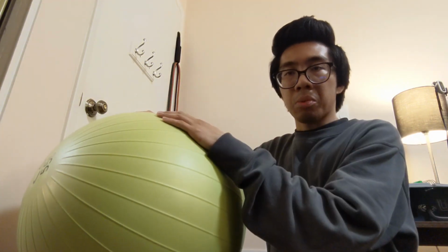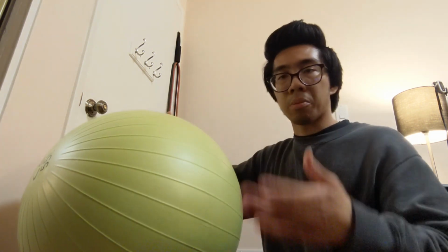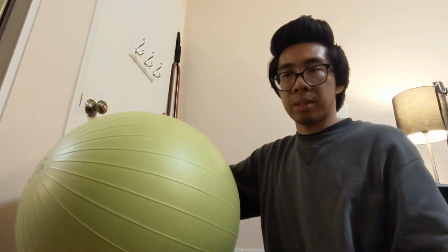An example of this in play would be having the child bounce on the ball while they are performing a puzzle or seeking increased sensory input. For the bolster, a child may use this in prone for weight-bearing activities and getting that proprioceptive input by activating those postural control muscles. This can allow for midline crossing and dissociation of the upper extremities. Also vestibular input, they could sit down and they can rock back and forth.